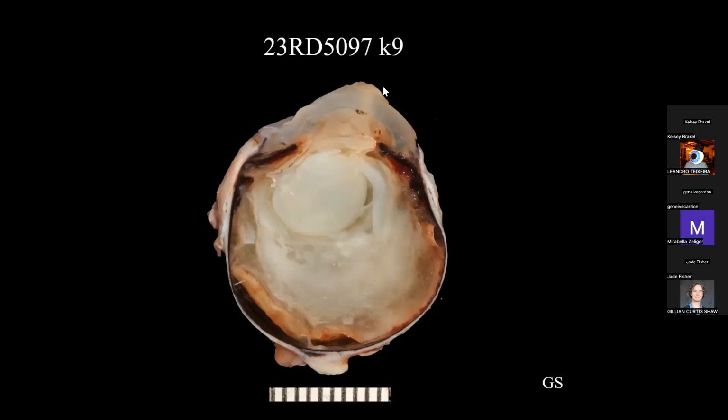We hemisected it, and there was a dorsomedial paraxial tan spot, which you can see here. It's not at the cut edge, but deeper to that. The globe is filled with exudate. The lens is opaque, and this material here is pretty consistent with lens capsule, which is discontinuous. So there was definitely this corneal perforation and this exudate inside the eye, and a pretty rockin' cataract, as I like to call them.